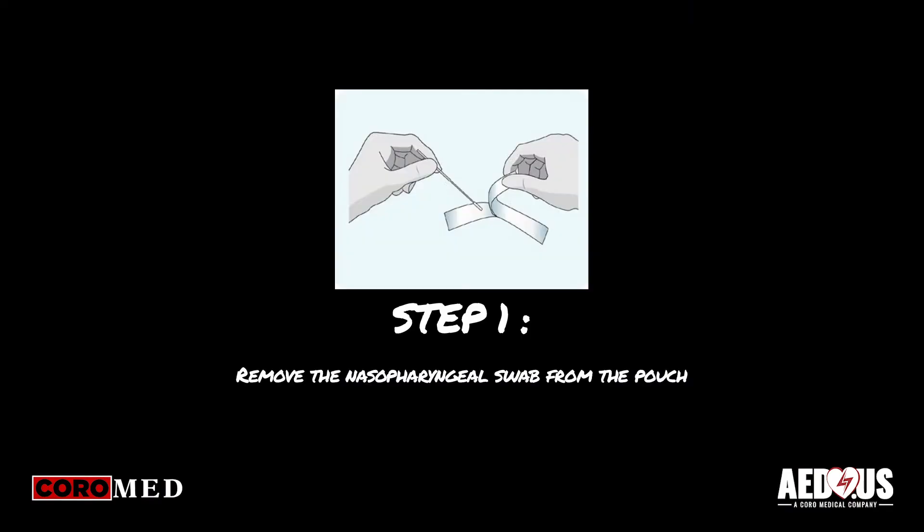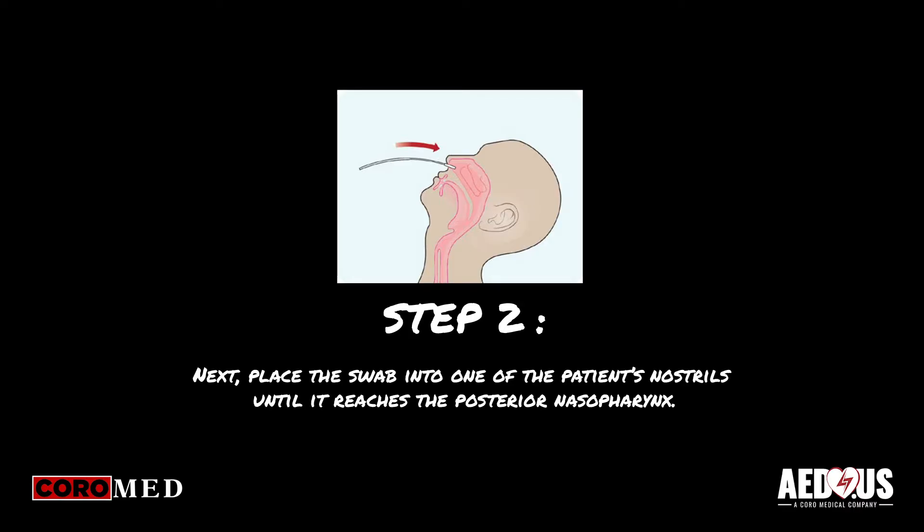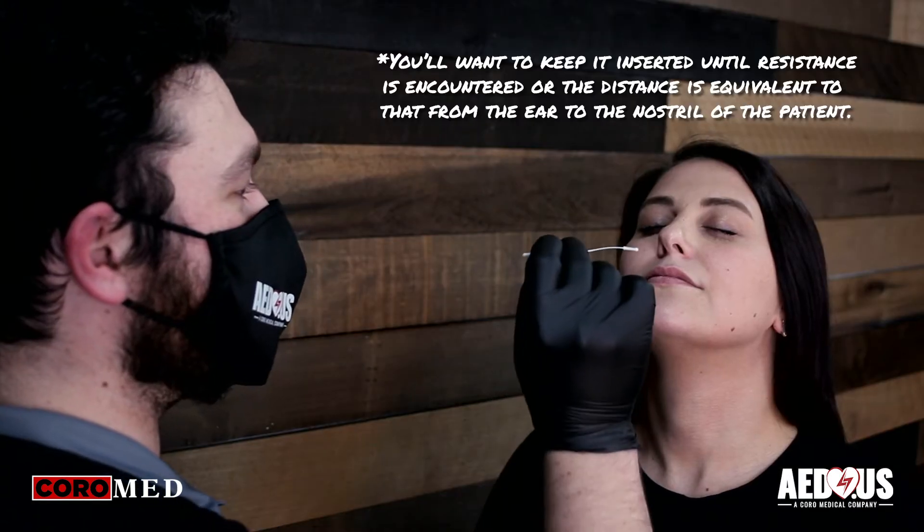First, you will want to remove the swab from the pouch. Next, place the swab into one of the patient's nostrils until it reaches the posterior nasopharynx.